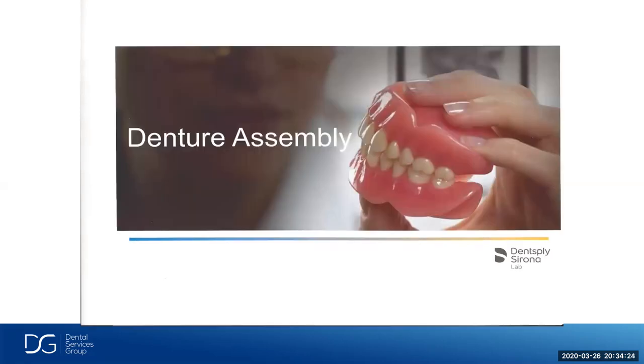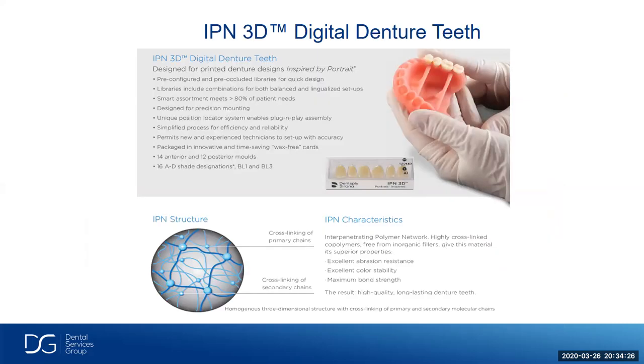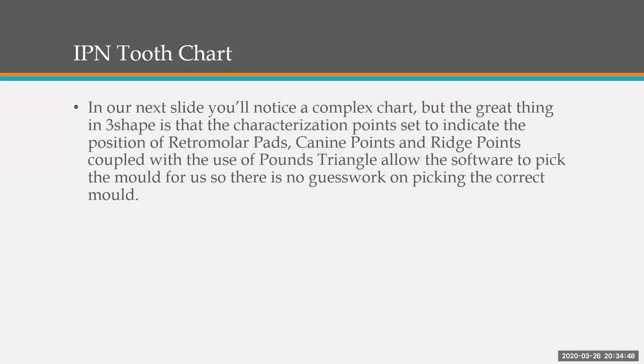So let's talk a little bit about the denture assembly. We're actually using IPN 3D digital denture teeth. And I'm sure many of you are familiar with the IPN denture tooth line from Dentsply. Very nice tooth. They're highly functional. They're wear resistant. And they design these teeth with a smaller ridge lap, so it'll be easier to incorporate them into the denture base. But in our next slide, you'll notice a complex chart.